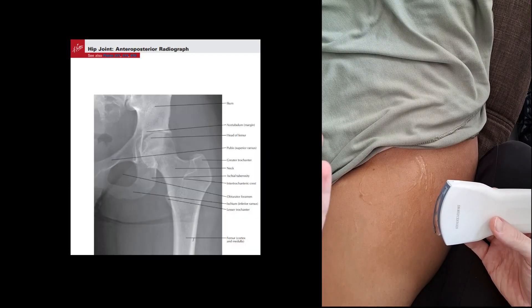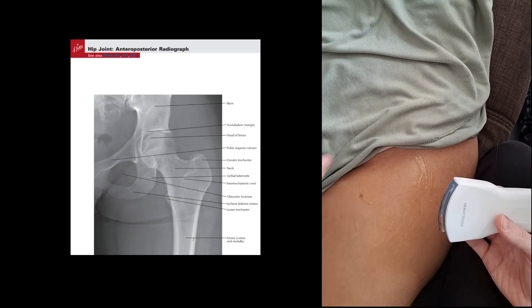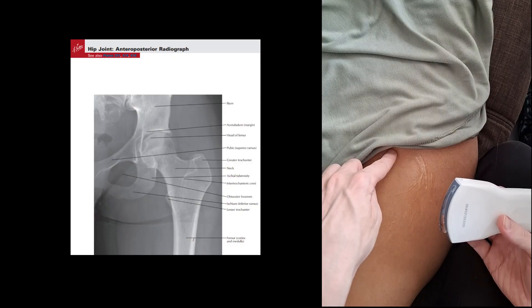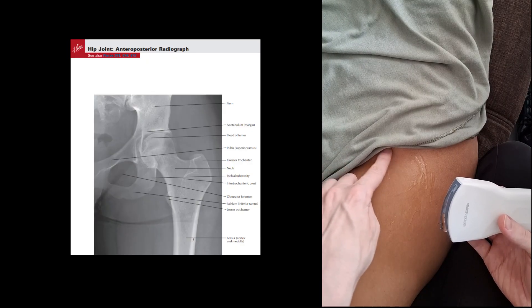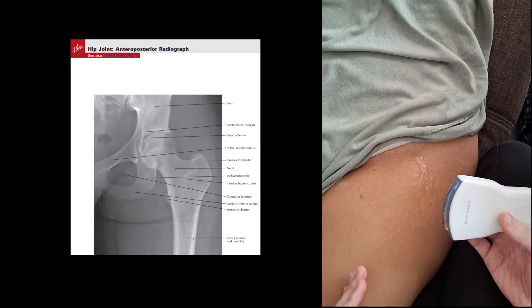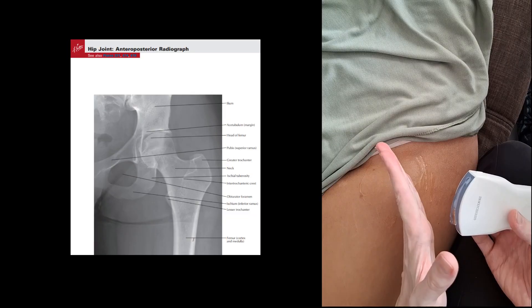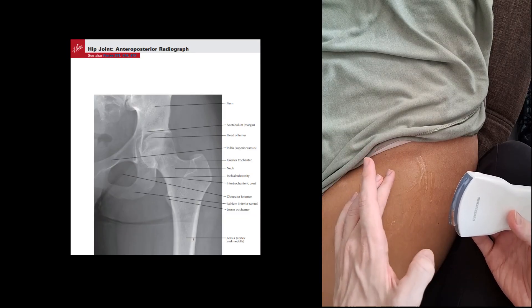We have our patient here and the patient is just lying supine. Sometimes I have the patient wear just baggy shorts or you can drape them. Underwear is fine — they can be wearing underwear because we'll be going up to the edge of the underwear. Here's the femur, and the neck of the femur is about here, and the head of the femur is about here.